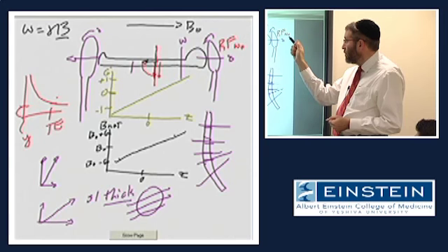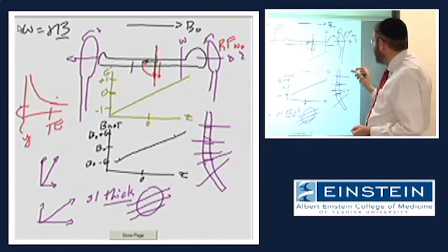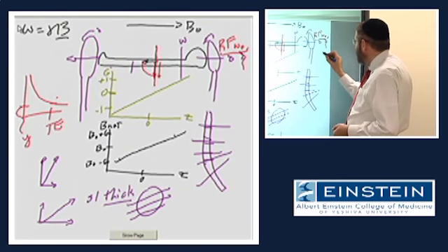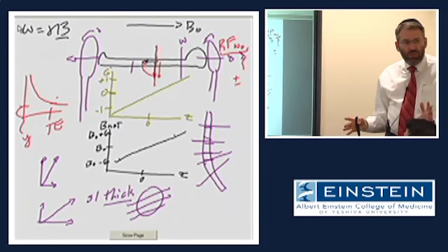So first, you have to realize that when we transmit this RF, we talk about, in this example, transmitting at the Larmor frequency. But the reality is that we are always transmitting some range of frequencies.